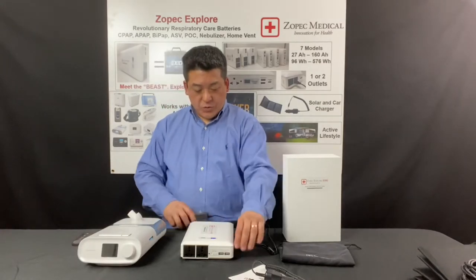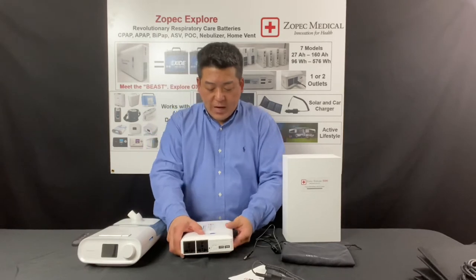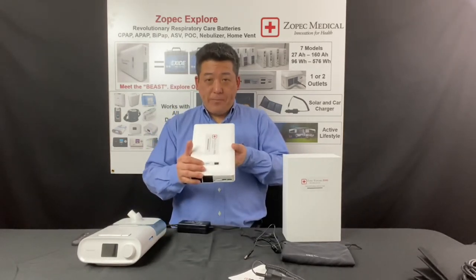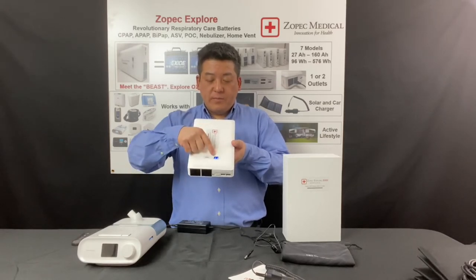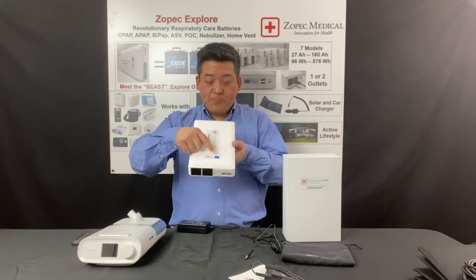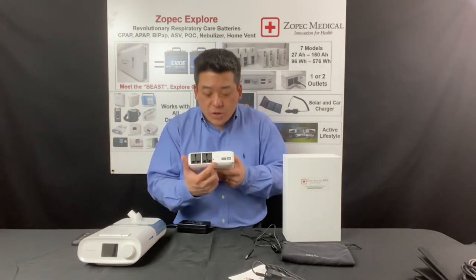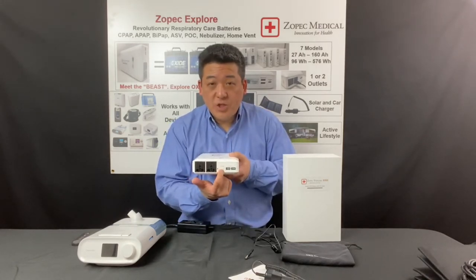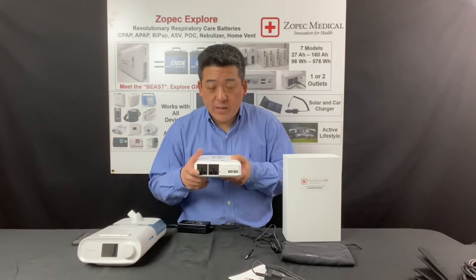To turn the battery on, all you have to do is press and hold the on/off switch on the top, and the capacity counter will light up. To turn on the outlets, you just slide the outlet switch to on, and the red LED light will light up, which means there's power to the AC outlets.